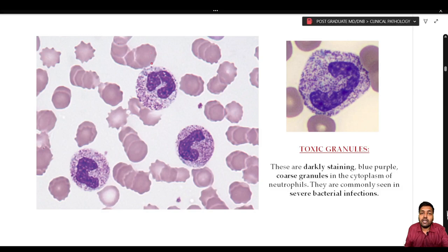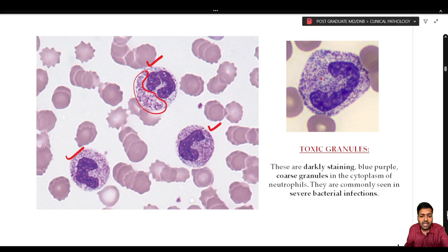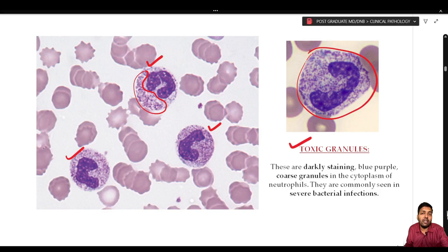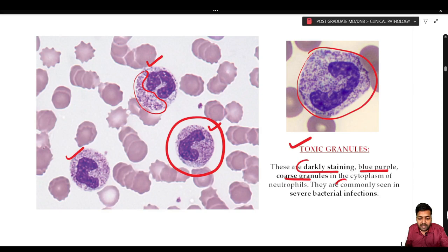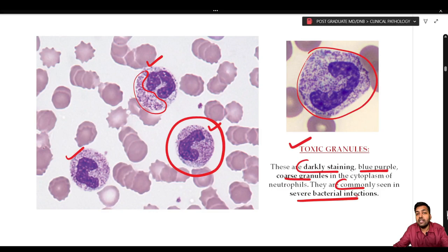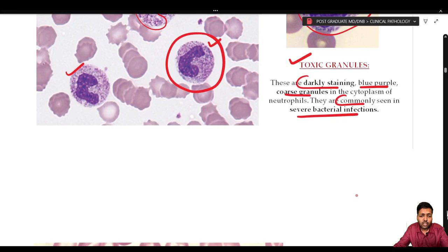When you encounter neutrophilia and see neutrophils with numerous coarse darkly-staining bluish-purple granules abundantly present in the cytoplasm, these are toxic granules. They are seen when all neutrophils have such coarse granules and are indicative of severe bacterial infection. A note can be given to the clinician that toxic granules are present.